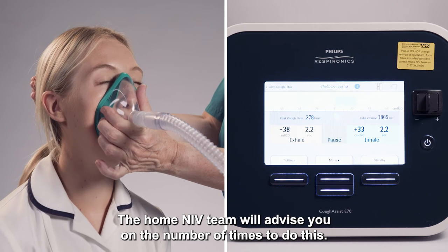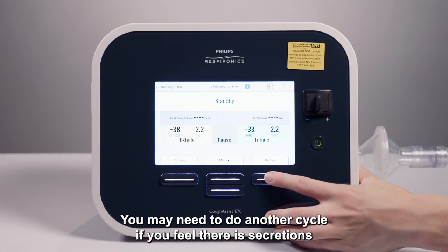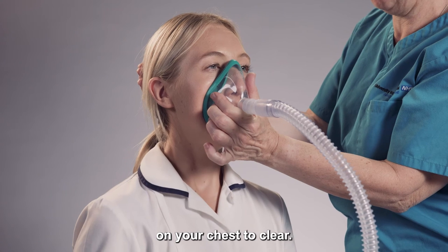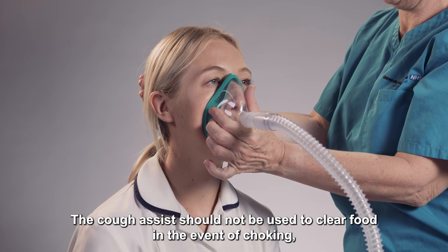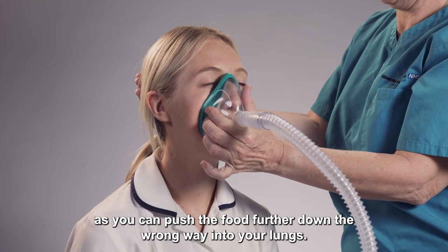The home NIV team will advise you on the number of times to do this. You may need to do another cycle if you feel there are secretions on your chest to clear. The cough assist should not be used to clear food in the event of choking, as you can push the food further down the wrong way into your lungs.